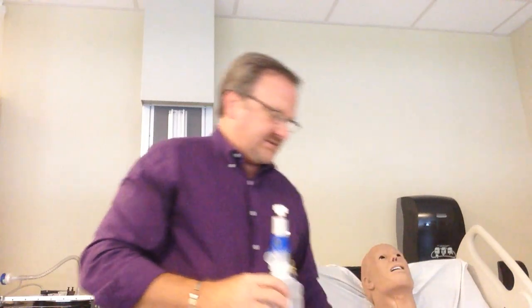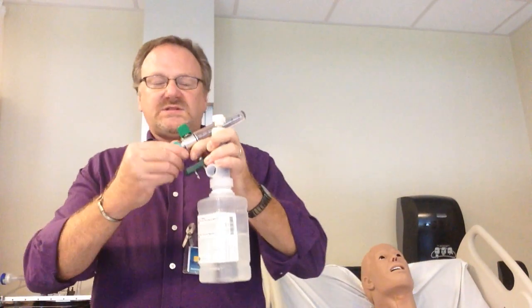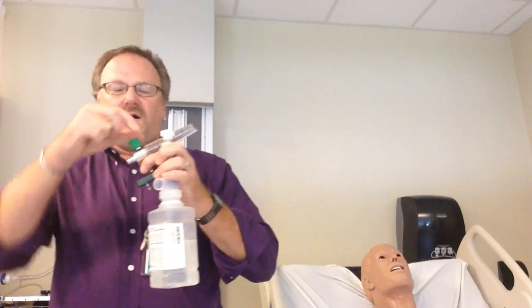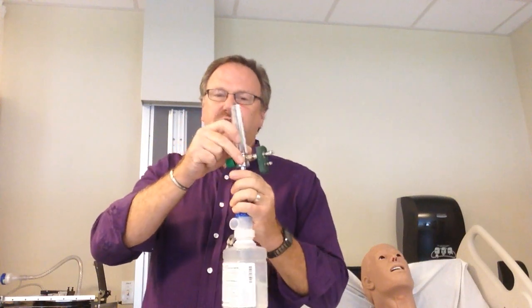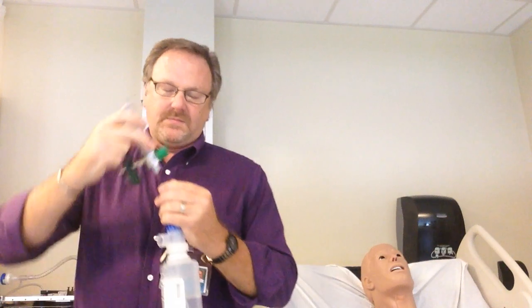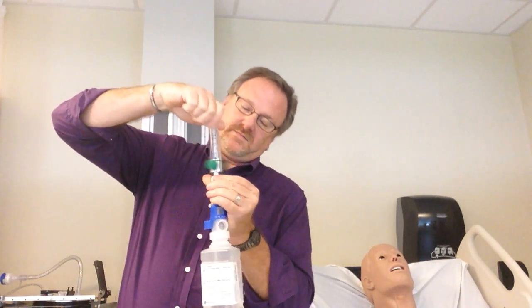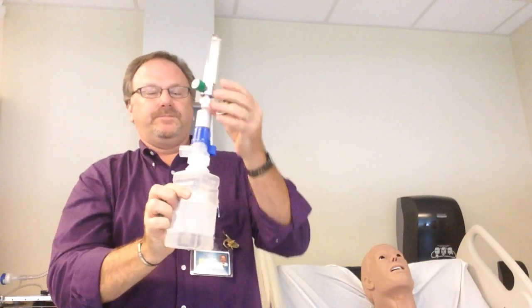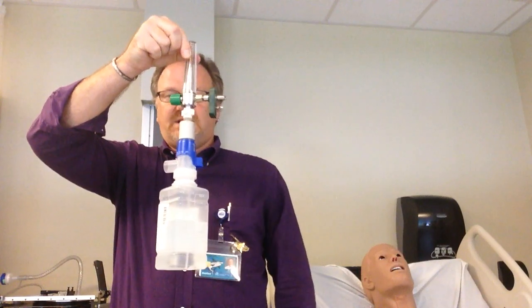Now, how do I set this up? This does not fit directly, so you must take the Christmas tree off of the flow meter. Typically this is going to be a connector to the wall, but just for the purposes of demonstration — and it connects just like that.